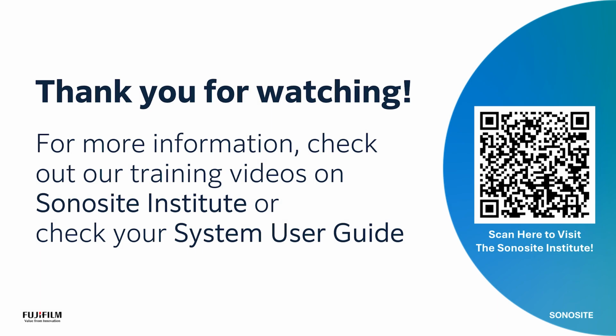Now it's time for you to explore on your own. Watch the how-to videos on the Sonosite Institute or refer to the System User Guide for more information.